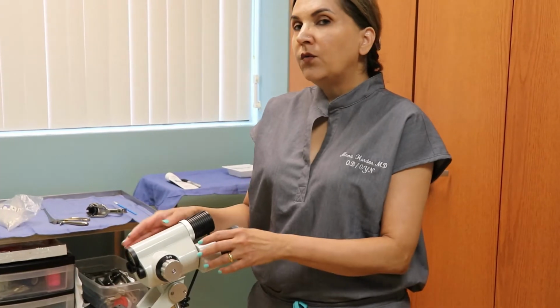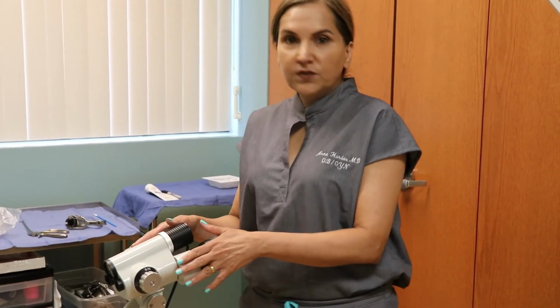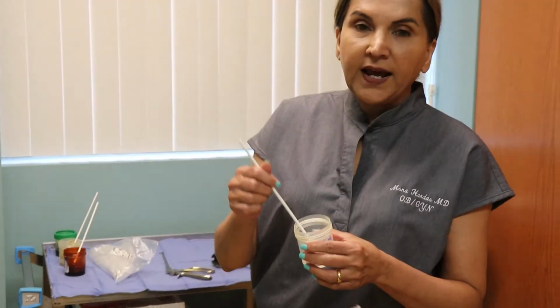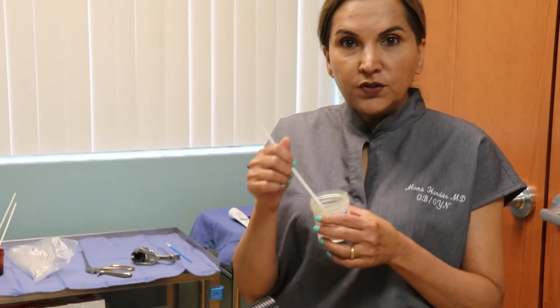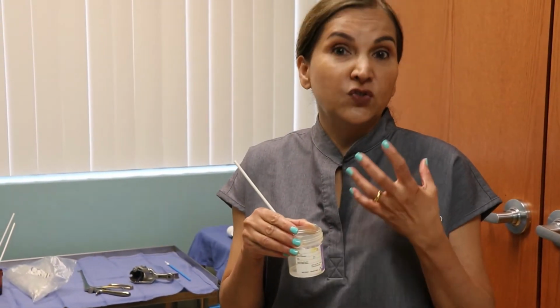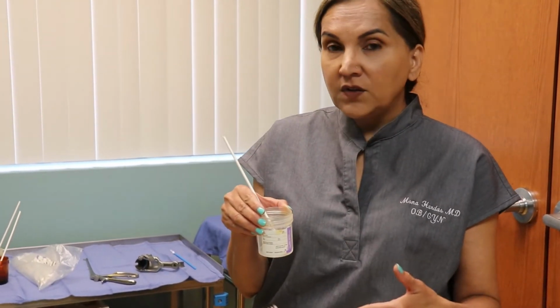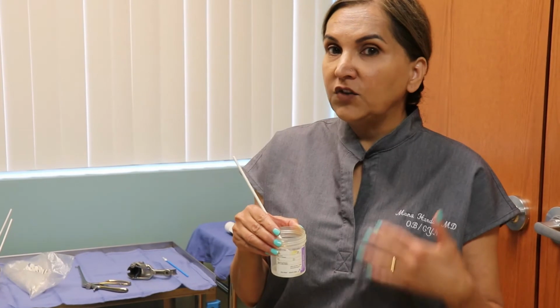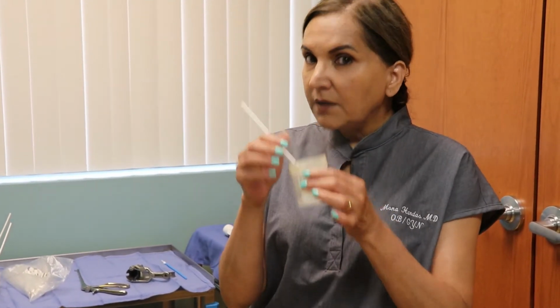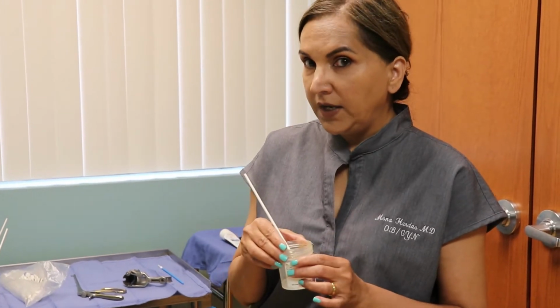Now once this gets focused, we use some chemicals. This is called acetic acid. We apply this acetic acid onto the cervix. What it's going to do is convert the abnormal cells into white cells. It looks bright white, which helps me look through this. Now remember, this is magnifying it for me 30 to 40 times what my eyes can see. With that, this chemical is going to show me the abnormal area.